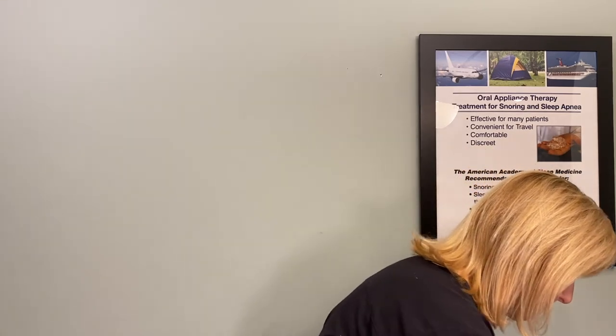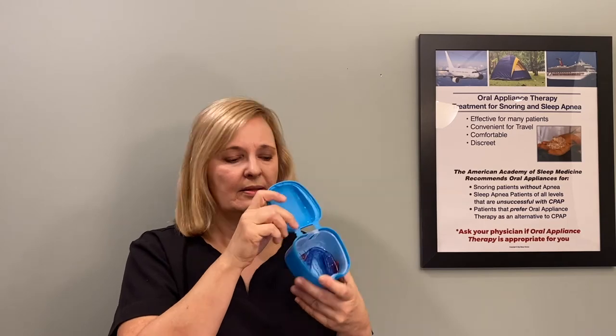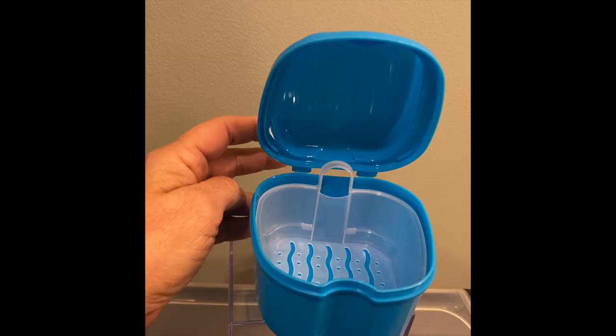We also have one very similar to the white one — it's attached so it doesn't have two separate pieces, and it also has a basket inside. The device fits in there very nicely. It's a deeper one, good for weekly cleanings. And if you're looking for something small, the very first case shown is really the best option for traveling.